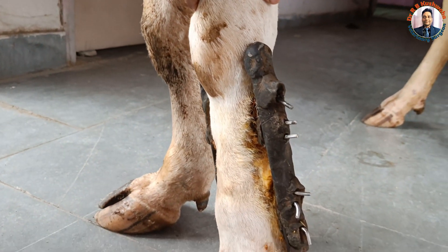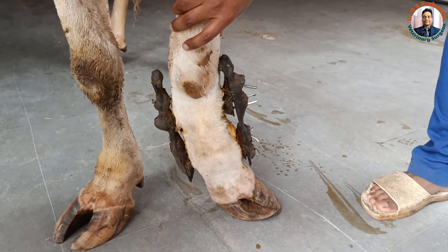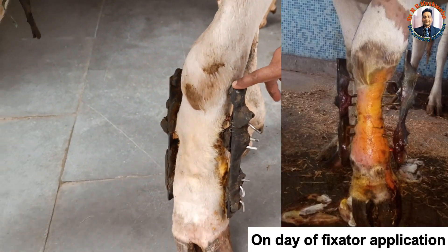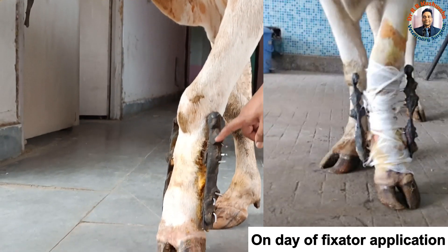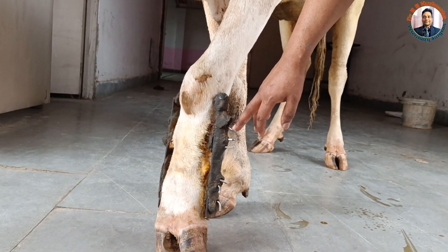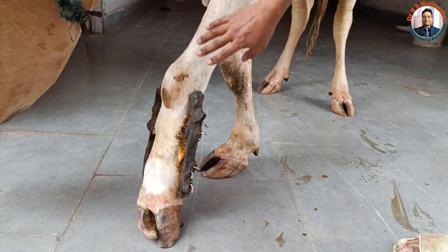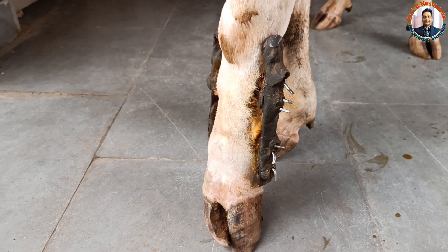We planned for fixation of this fracture using the transfixation technique, or modified epoxy. Normally we make the frame with M-Seal, but because this animal is an adult, we made the bar with iron bars on the medial and lateral aspect. We passed three pins in the digital segment — three above and three below — using 4mm intramedullary pins.